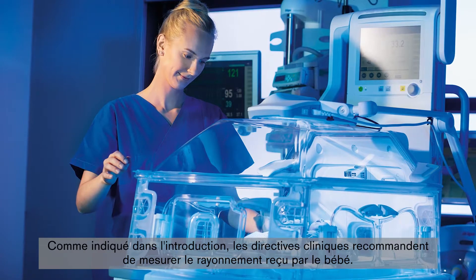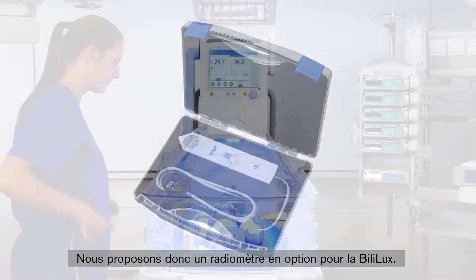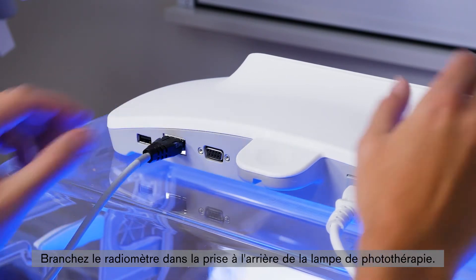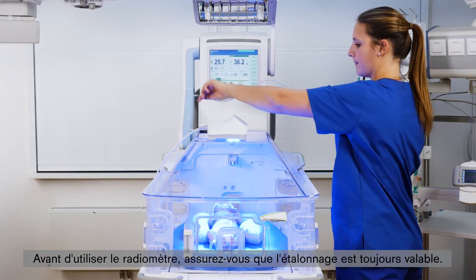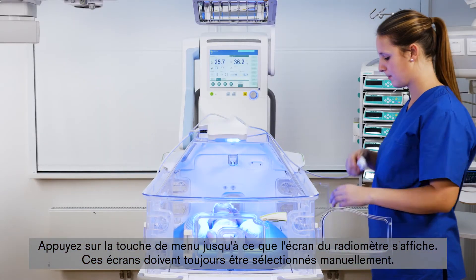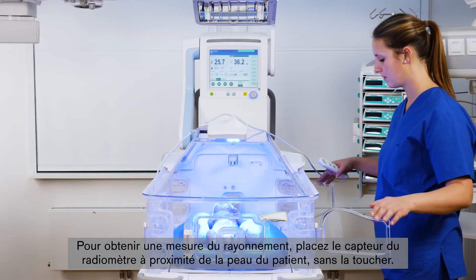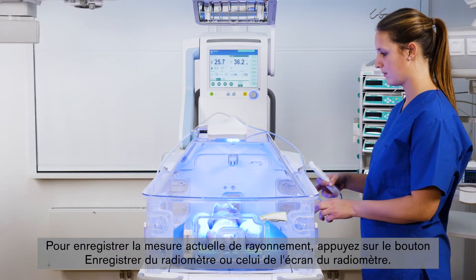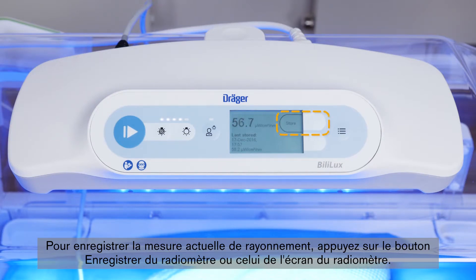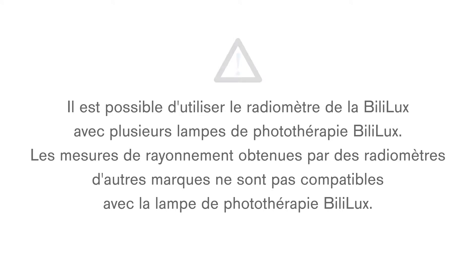Clinical guidelines recommend measuring the irradiance that the baby receives, so we offer a radiometer as an option for the Bililux. Plug the radiometer into the receptacle on the rear of the phototherapy light. Before using the radiometer, make sure that the calibration is still valid. Press the menu key until the radiometer screen is displayed — you always have to choose this screen manually. To obtain the irradiance measurement, position the radiometer sensor close to the patient's skin without touching the patient. To store the current irradiance measurement, press the store button on the radiometer or on the radiometer screen, and confirm that the last stored information at the bottom of the screen is updated. Note that irradiance readings obtained by different manufacturers' radiometers for the Bililux phototherapy light cannot be compared.